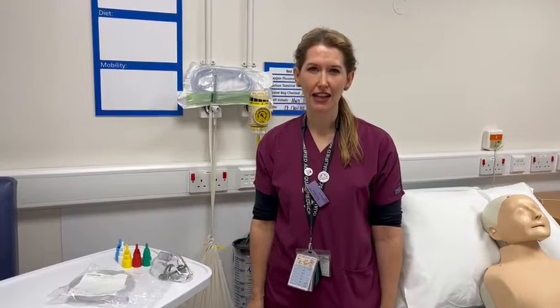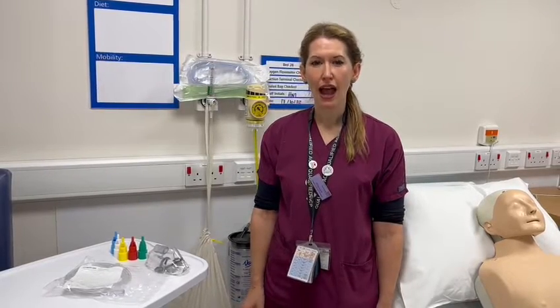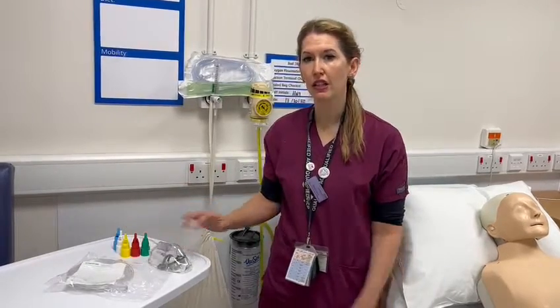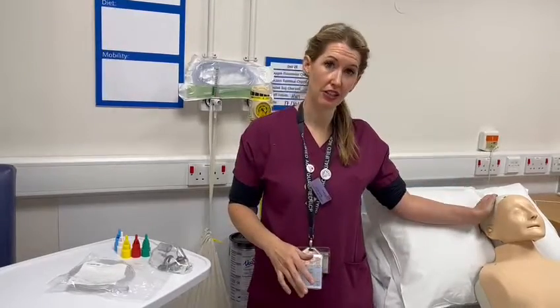Hello, my name is Kirsty Lang. I'm one of the respiratory ACPs working here at Harrogate Hospital. This video is going to go through how to use the Venturi oxygen delivery devices that we use in the hospital, how to apply them to the oxygen port, and more importantly, how to apply it to the patient.